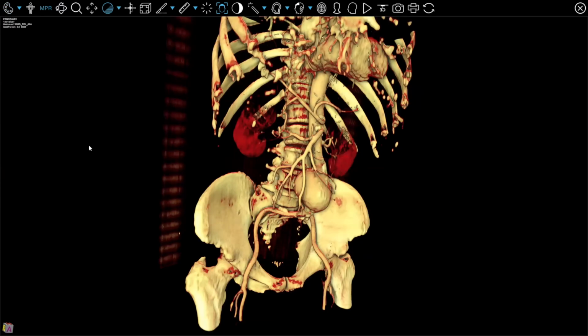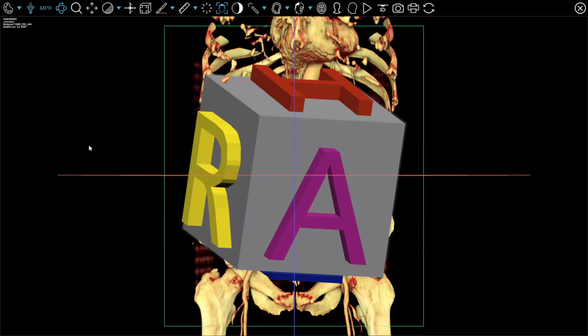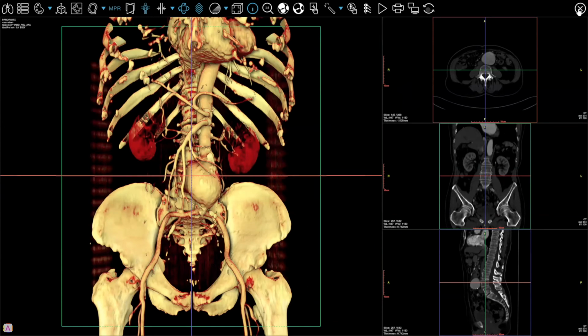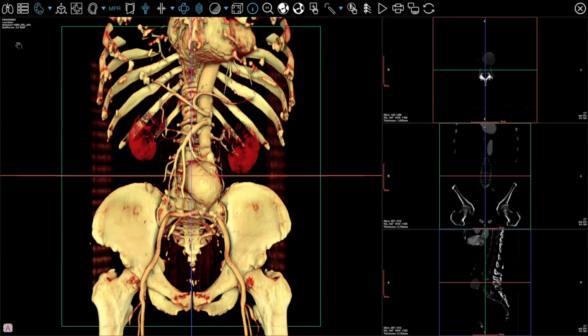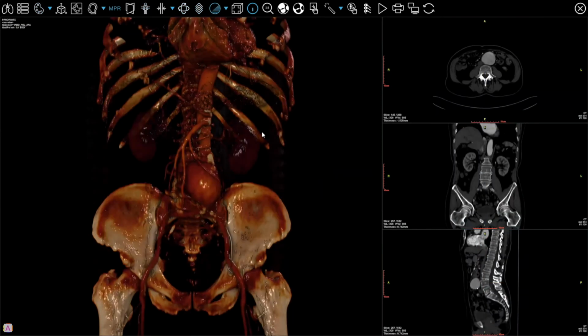Faz a segmentação aí, Cláudio, para a gente ver. You can definitely navigate through all the presets, but now we will do the segmentation. It's very simple to do. That's one of the beauties of the solution as well. You adjust the correct preset we need, navigate through it, and now he will tag the parts he wants. He can have a visual confirmation of this segmentation, because it is going to be highlighted on the main screen.